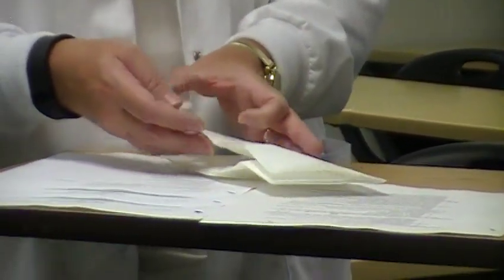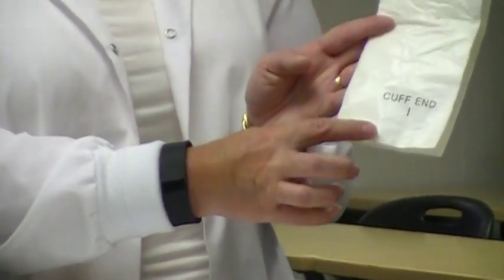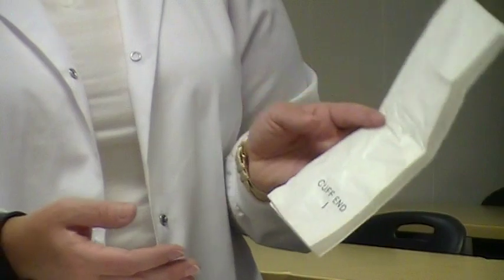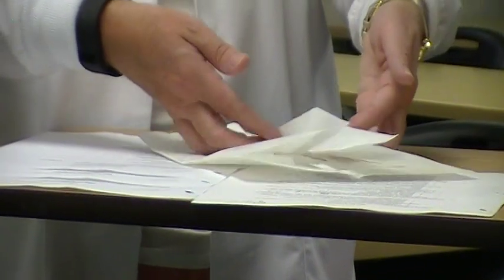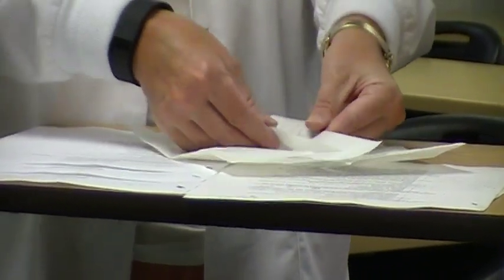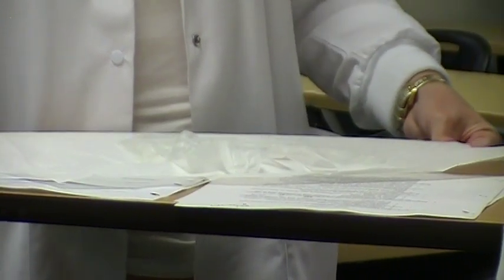So I'm going to open it, and it tells me here on the package it says cuff end. So I'm going to put that facing me. I'm going to open it up. It says right and left. So next I'm going to grab the tabs at the sides, and again, just very gently pull that open and kind of straighten it. Sometimes it wants to fold back in, but if you straighten it, it holds the gloves kind of in place.